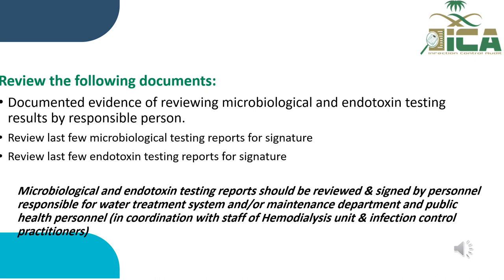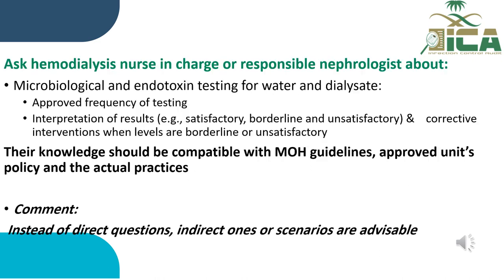Microbiological and endotoxin testing reports should be reviewed and signed by personnel responsible for water treatment systems and maintenance departments and public health personnel. Ask the hemodialysis nurse in charge or responsible nephrologist about microbiological and endotoxin testing for water and dialysates, approved frequency of testing, interpretations of results, and corrective interventions when levels are borderline or unsatisfactory. Their knowledge should be compatible with MOH guidelines, approved unit policy, and the actual practice.